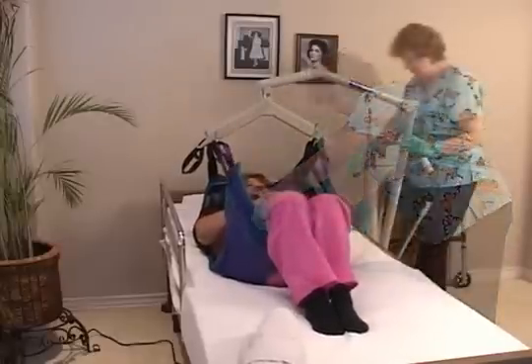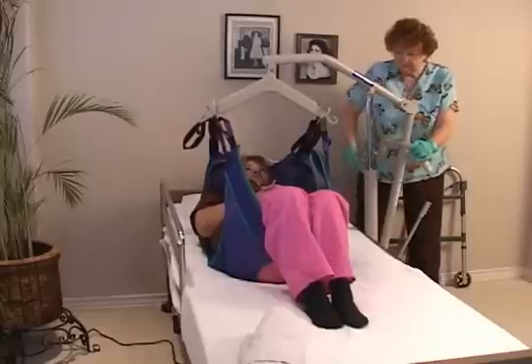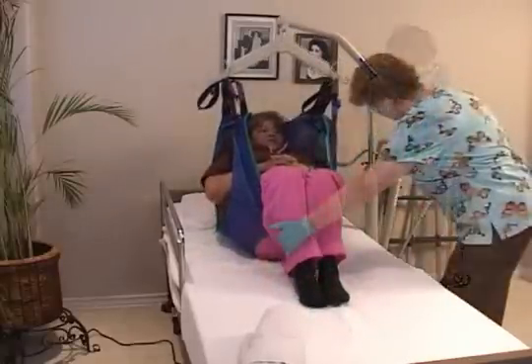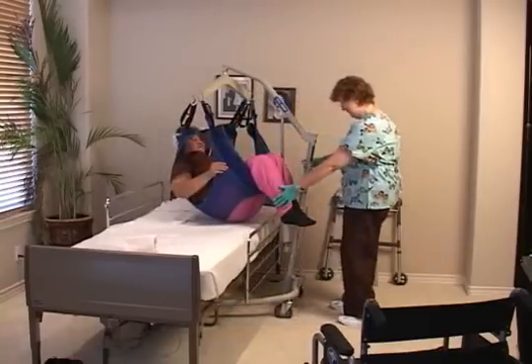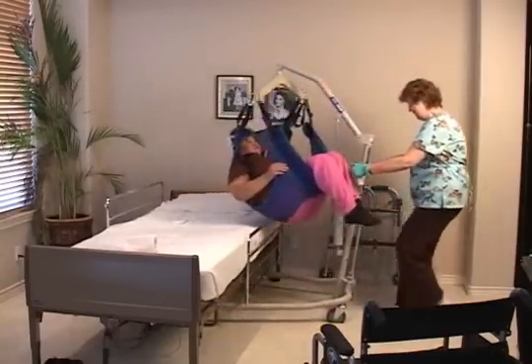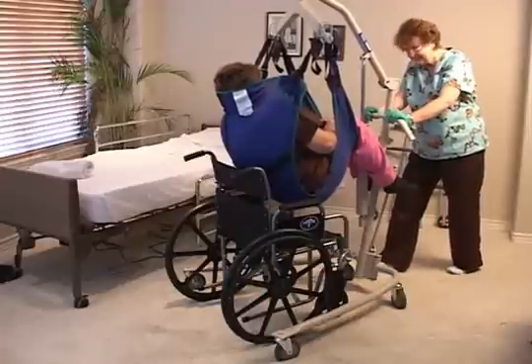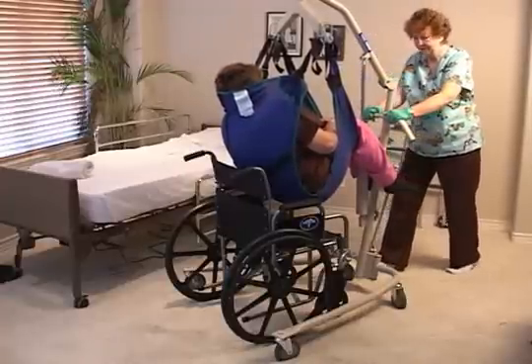24th, lift the resident up several inches above the bed surface. 25th, gently swing the feet away from the bed. 26th, then position yourself behind the lift. 27th, steer the resident away from the bed and toward the wheelchair. 28th, center the resident into the wheelchair.